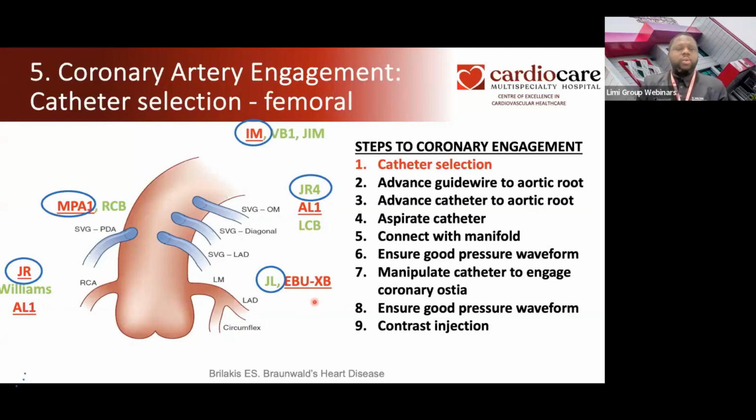doing a diagnostic. So one of the typical ones we use more often than not is the EBU or XB. EBU means extra backup. It just gives extra backup. So when we pass this guide in, or the catheter in, it goes in like this, comes in, and it just sits here. I hope you can see my annotation. So when we pass the catheter straight from the femoral right down, it goes in like that, comes out. So it goes in like that, typically rests on one of the cusps, and it doesn't even need any serious skill per se. It just gets in like that.